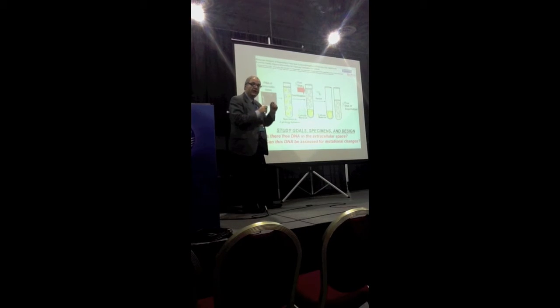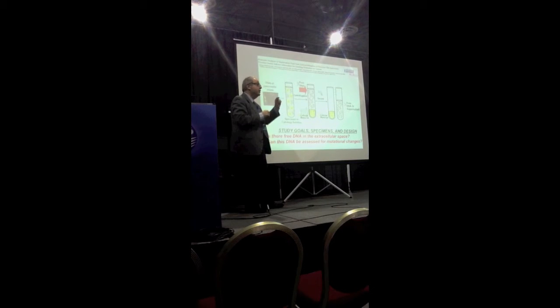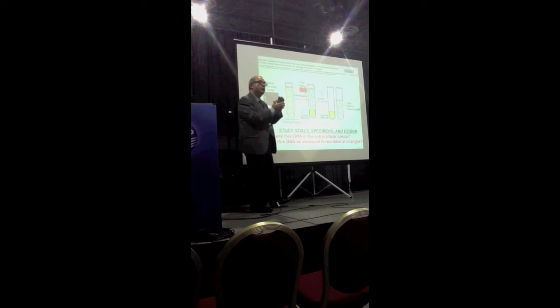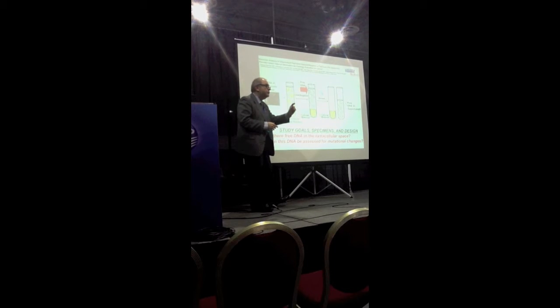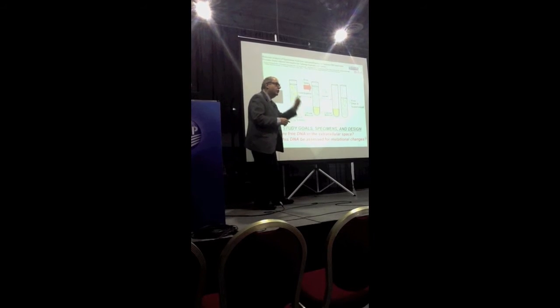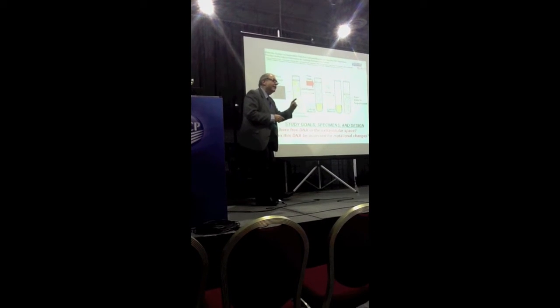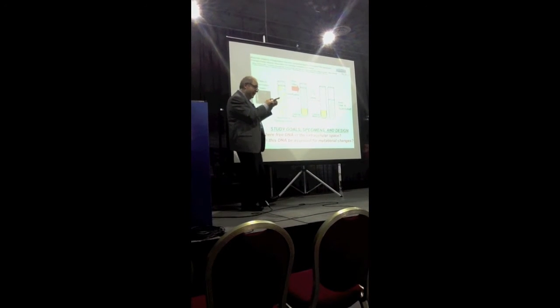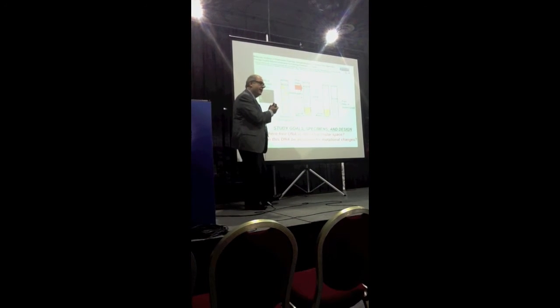It is usually the practice in cytology to centrifuge the sample at some point, pellet the cells either into a cell block or onto these slides. That leaves you with a supernatant, a cell-free supernatant that's usually discarded. We hypothesized that there could be DNA in that cell-free supernatant, DNA likely from the same cells that one is trying to make a diagnosis.